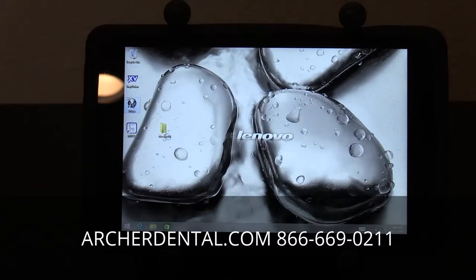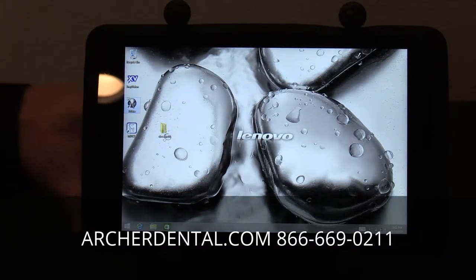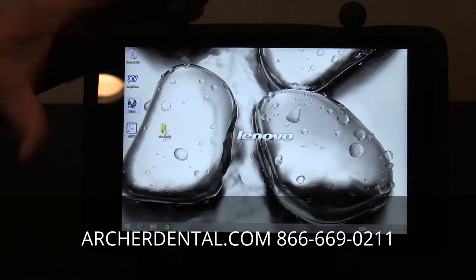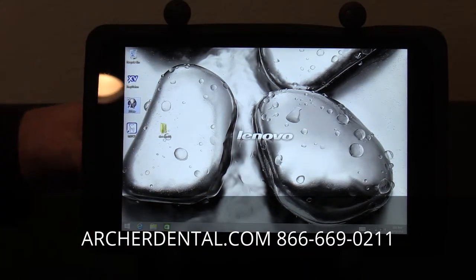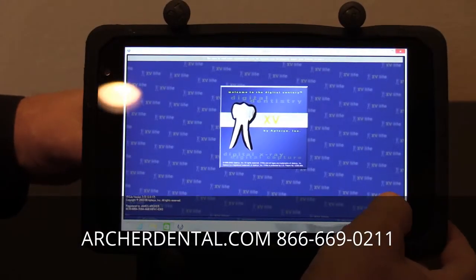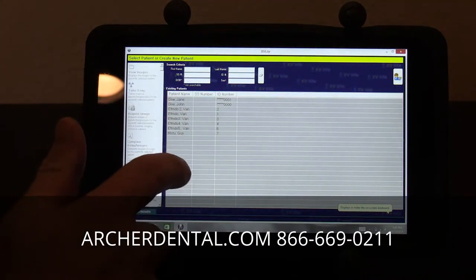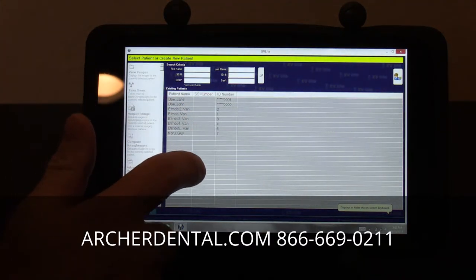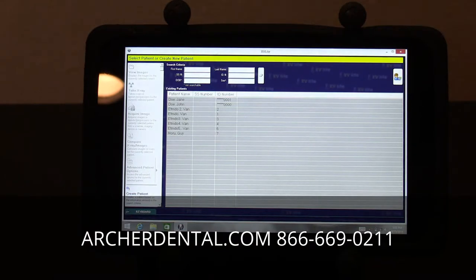Today we have the Vector MaxRay All-in-One, and here's a quick start guide. You want to open the pre-programmed XV light program by touching XV light. From there, you're able to either select an existing patient that's already been entered, or enter your own patient and save. Let's say we want to go into an existing patient and take a follow-up X-ray.